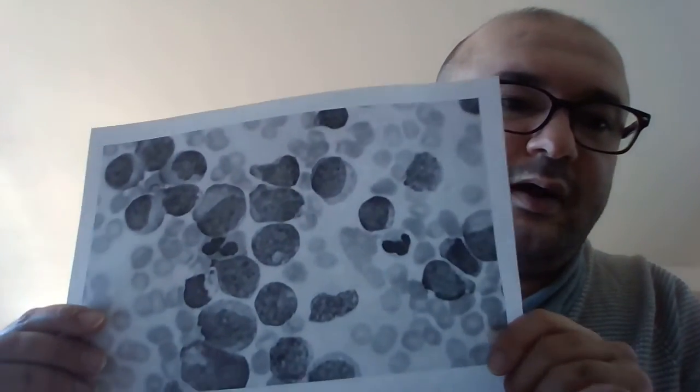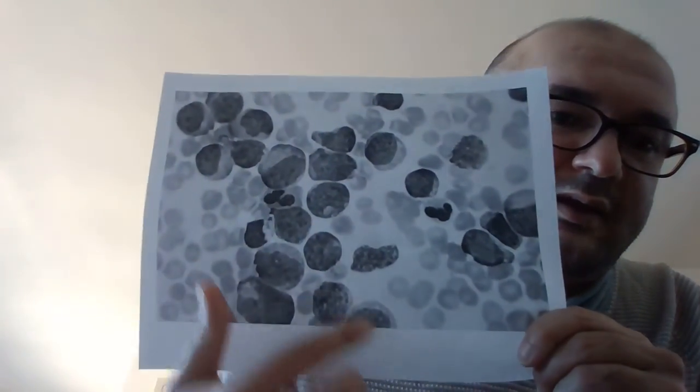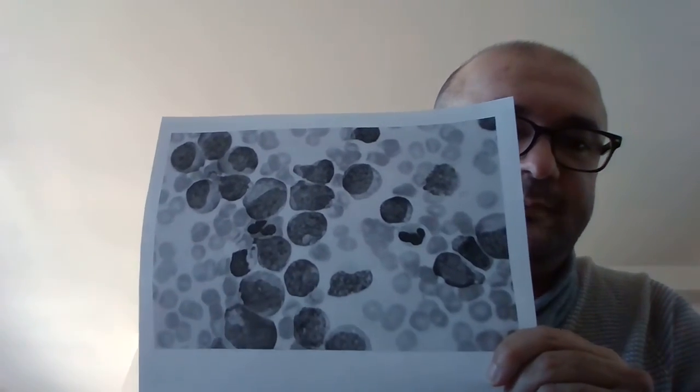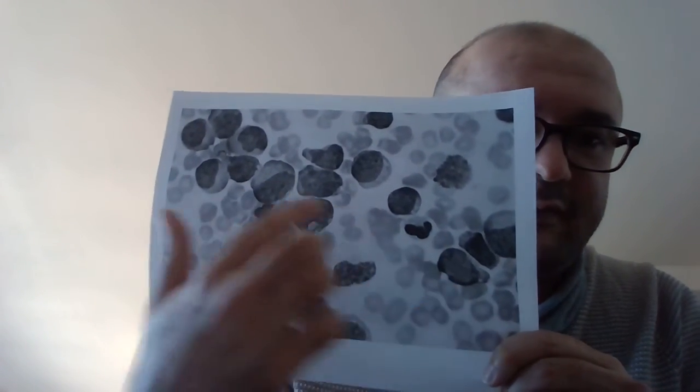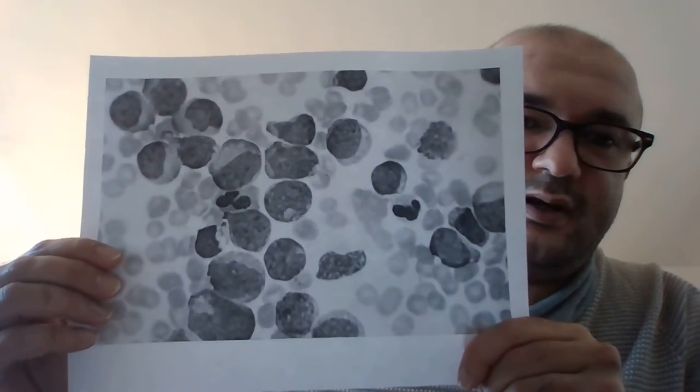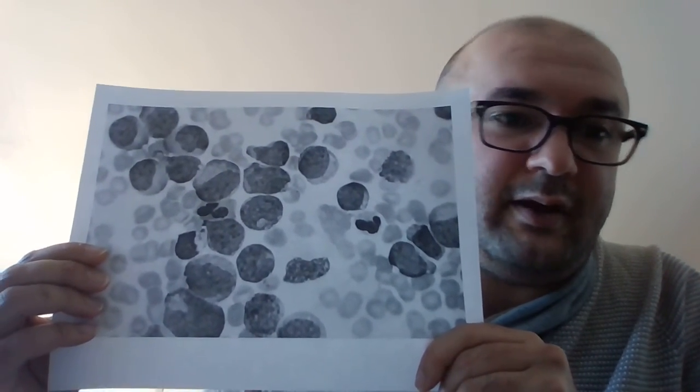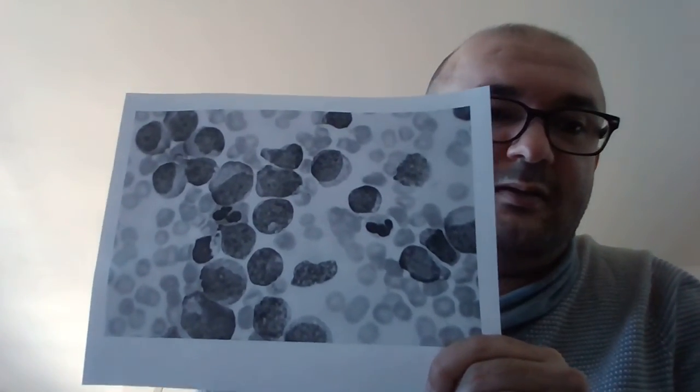And if you want to illustrate under the pathology, we can see the extraordinary number of white blood cells. It can be seen here, like basophils and types of neutrophils. This picture illustrates CML, called chronic myeloid leukemia. It's chronic, and it can be managed by physicians. And this was the gist and a brief illustration of what I learned in the blood cells section.